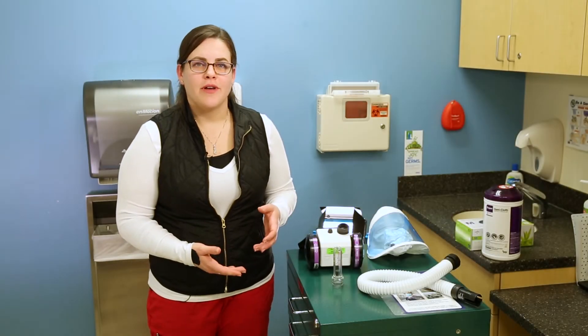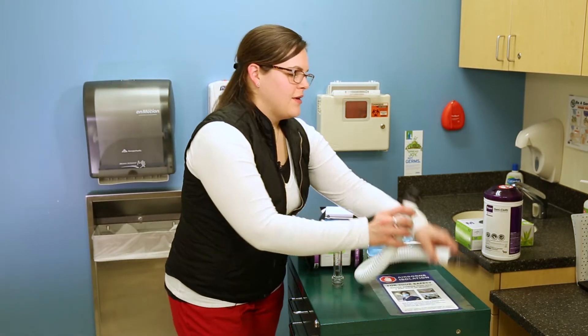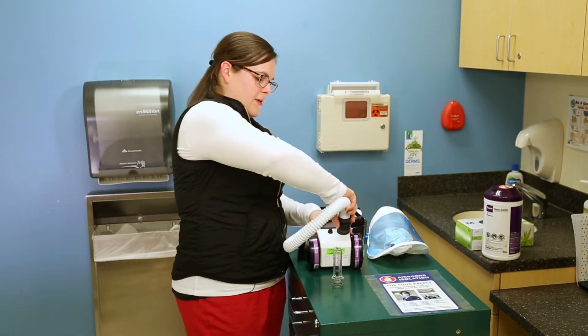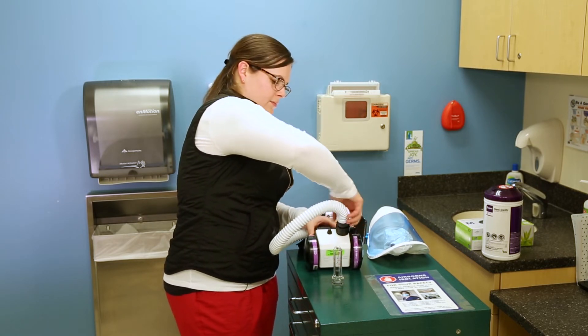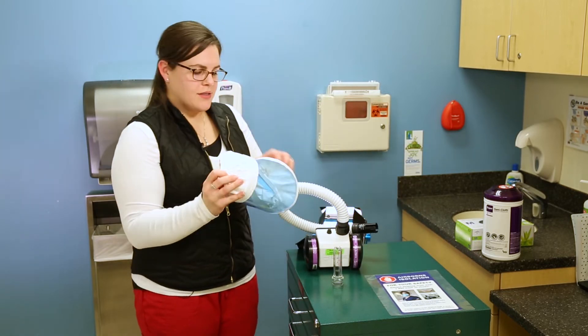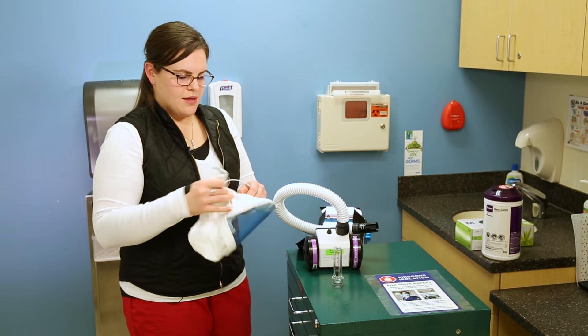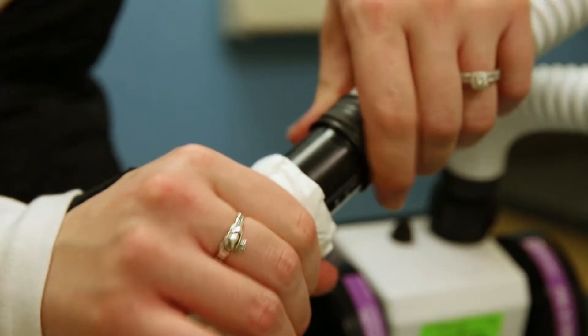After checking your airflow, you can put your machine together. First, attach your hose by twisting it back on. Next, you'll take your hood and attach it with a click.